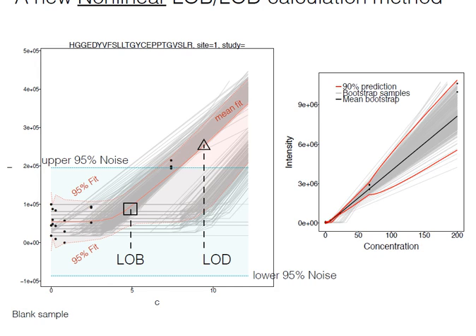Depending on the data that we resample, we either fit this straight line or this elbow function. And then in the end, we just average all the fits that we get, and we get a mean fit in red here, which is the calibration curve. You see here that we really capture this threshold well at low concentration, and we get a linear response at high concentration. The nice thing about this method is that if the data is linear, the mean fit will be completely linear, which is a huge advantage of this method.